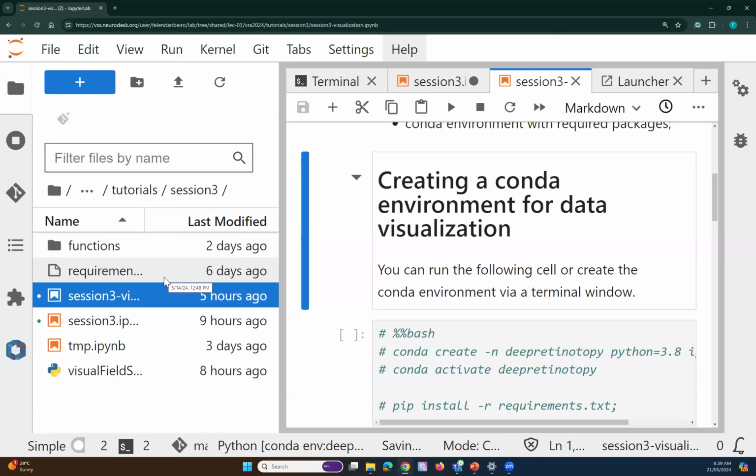Yeah, because I think that would be quite useful for people that don't have the functional data. So yeah, I would appreciate help. Probably depends a lot on the quality of the T1, I think. Yeah, so T1 quality is probably one critical parameter. Because the HCP is actually 3T T1, but it's 0.75 millimeter, and they're not too shabby. I mean, there's better T1 data out there, but they're at least at 0.7 millimeters, so their surface reconstructions are reasonably good, better than what you get from a 1 millimeter T1.